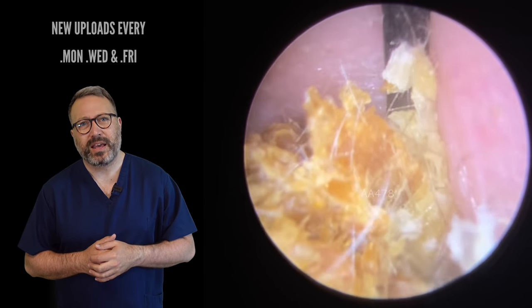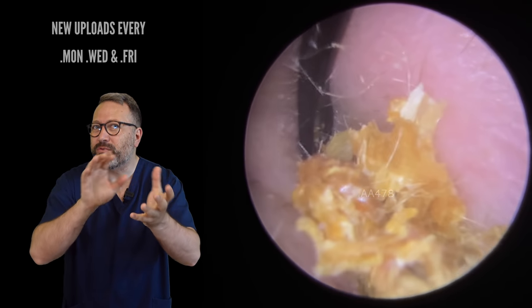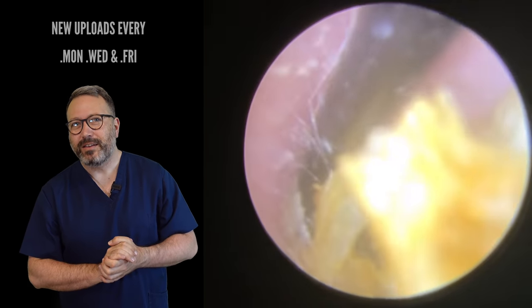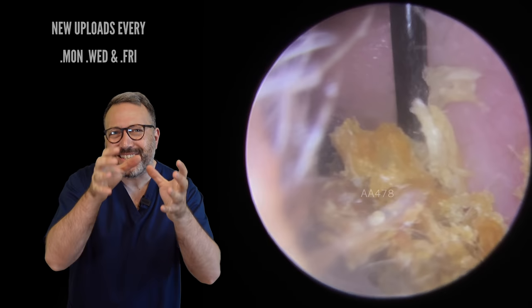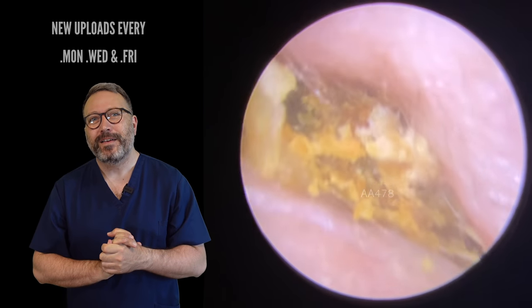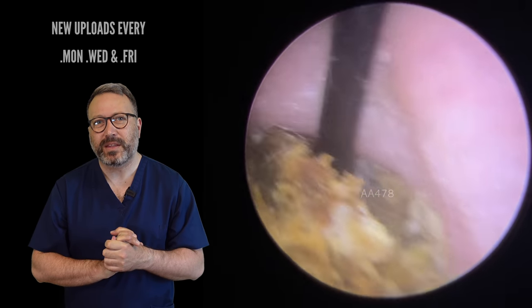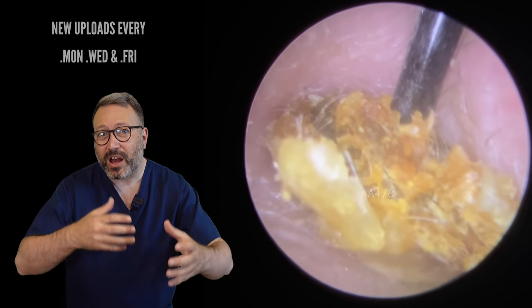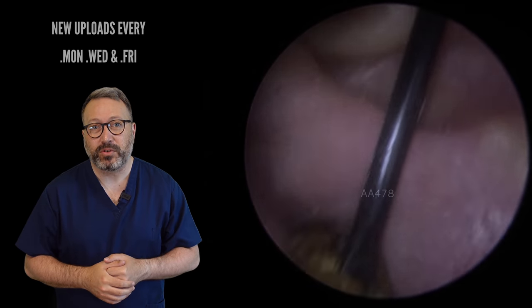We've got a loose end. I've got a better grip there on the side. See how it's slowly, slowly pulling out, but it's starting to fold around. I've switched position now, trying to get a little bit further behind it because it was starting just to unfold. I'm trying to sneak around the corner to break this down. Just working to that left side, very slowly, steady pressure here — it's on its way. It just folded over as it came out there, almost crashed into the camera. We've got a little bit more that's been pulled forwards now, so let's get behind this next section. Steady backwards movement, drawing this out — it's moving, it's all starting to shift. And out that popped — almost crashed into the camera it came out so quickly.